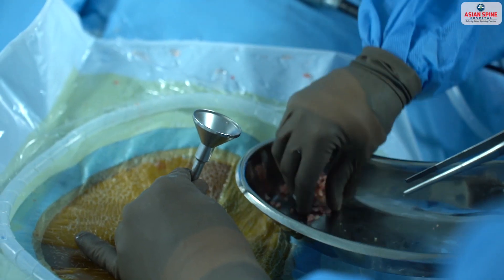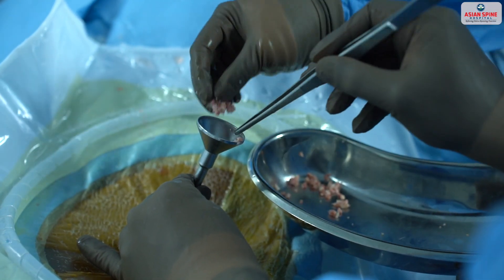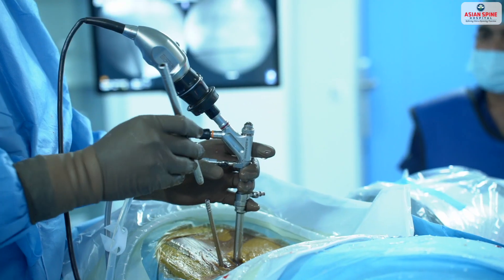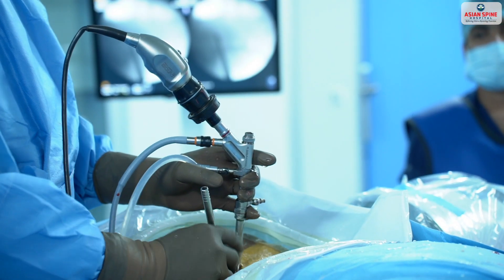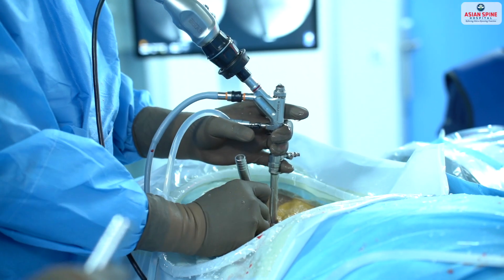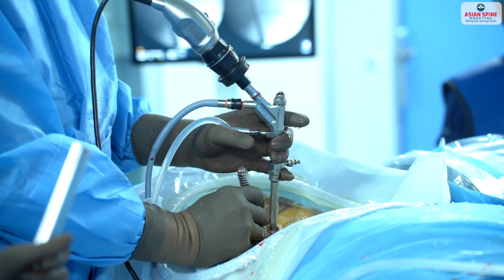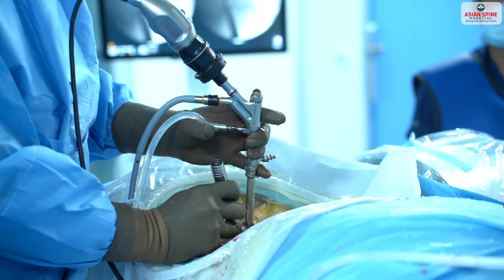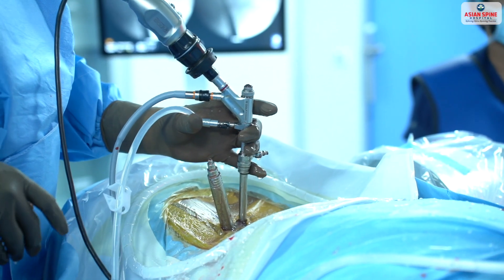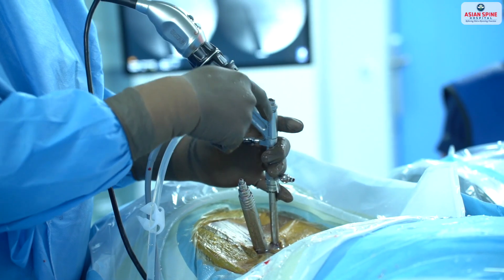The graft is placed with the autograft which we have taken — the patient's own graft. Once the graft is packed, serial dilators are placed through the incision where the screws will be placed. We place a dilator, and these dilators are being seen with the endoscope as they go till the disc space.